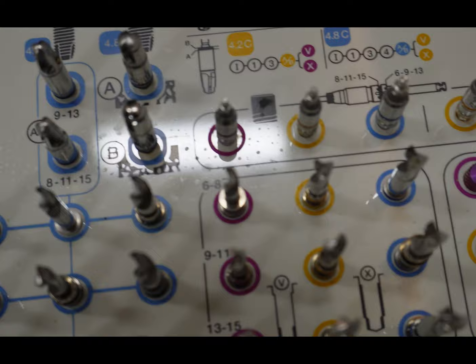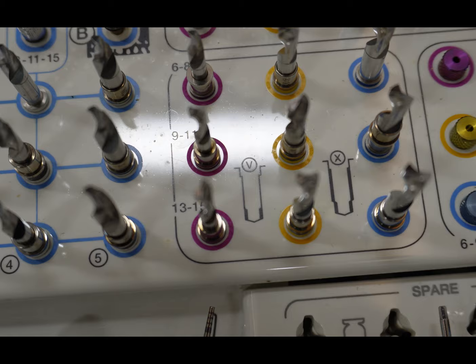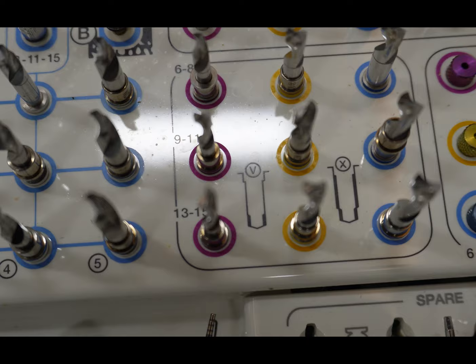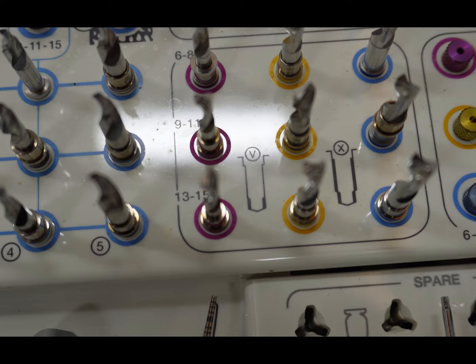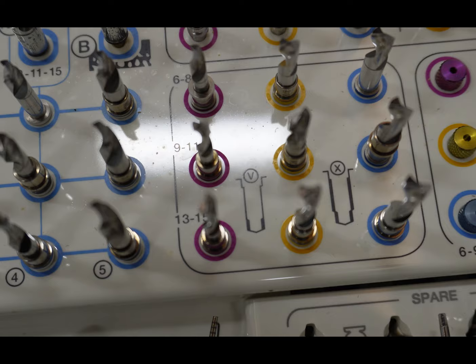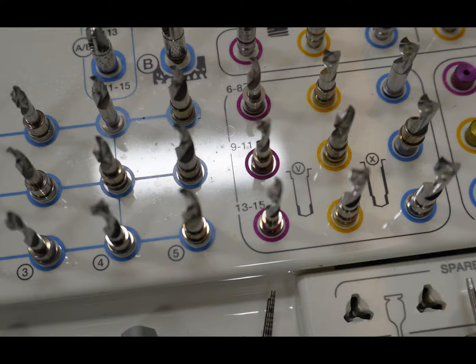We also have extra burrs here — the V or X burrs. These are color coded and sized based on the guided position and which sleeve you're using, depending on the diameter of your implant. The V is only going to drill out extra at the apex of the implant, and the X is going to drill out extra on the wall as well. In dense bone such as the mandibular posterior you might find you need to over-prep to get that implant to go down without over-torquing as it reaches its last few threads.